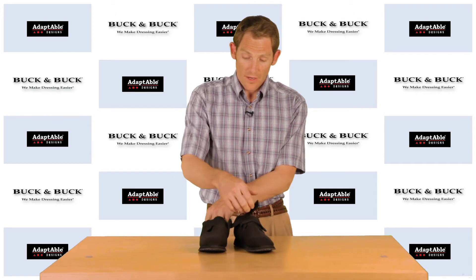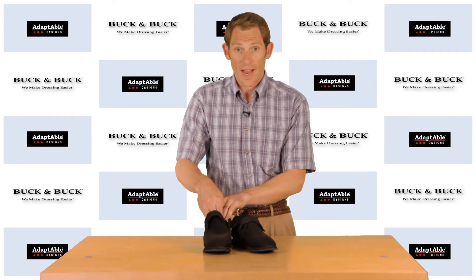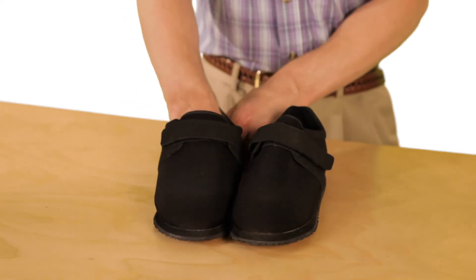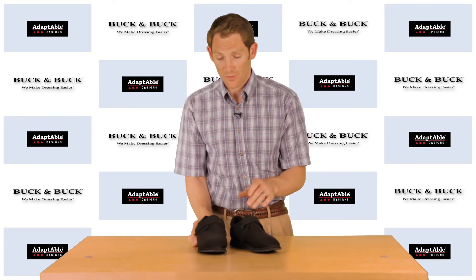It's very easy to put on. You have this velcro strap which opens very wide — you can get your foot in very easily. Once it's on, you just close the strap for a nice snug fit which is suitable for walking.